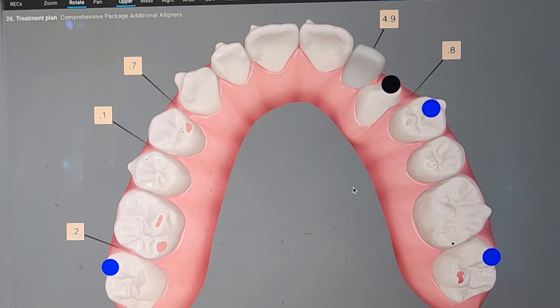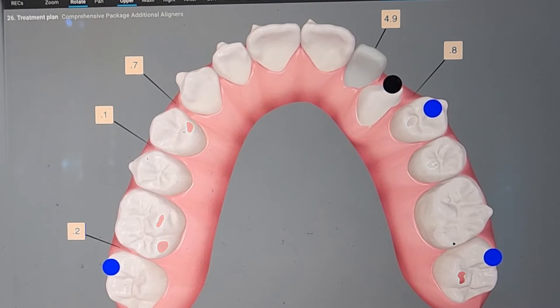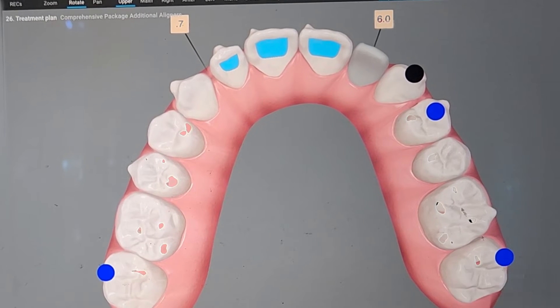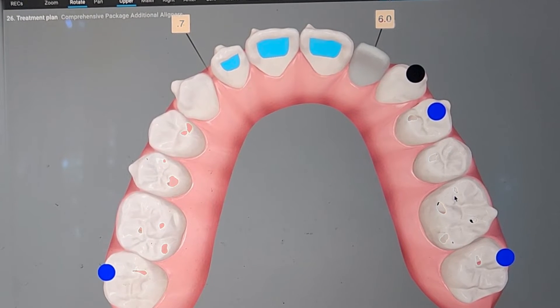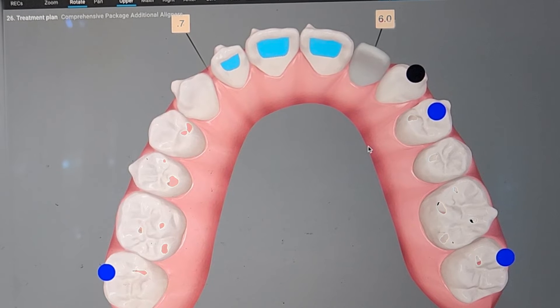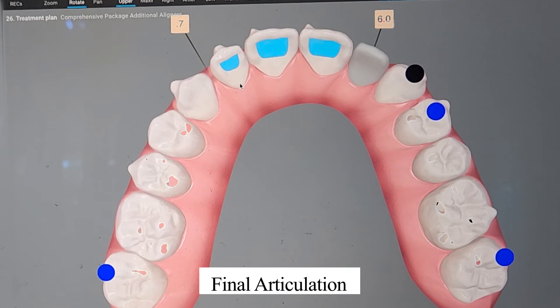And you do the same thing at the end. When you finish the case, you want to see nice, even posterior contacts — multiple points of contacts, at least on molars. I know we're probably gonna have another refinement here, so I wasn't worried about the sevens because they're not fully in. Premolars, maybe canine guidance — we'll worry about that later. But no anterior contacts at the end. So that's the first thing I do: initial and final articulation.